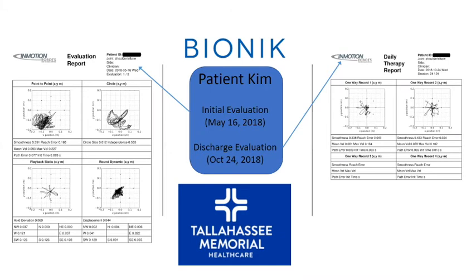But not only does she achieve that, in that flexor pattern she is also able to break out of it enough that on the northwest side, she's actually able to hit the target, which is a huge gain as well. That's the difference between being able or unable to reach a plate and now being able to reach it. And that's huge, as Sue mentioned. For her, that was a big success.